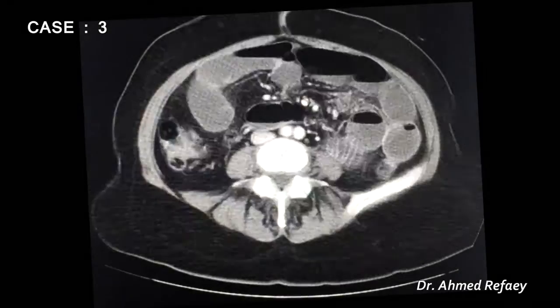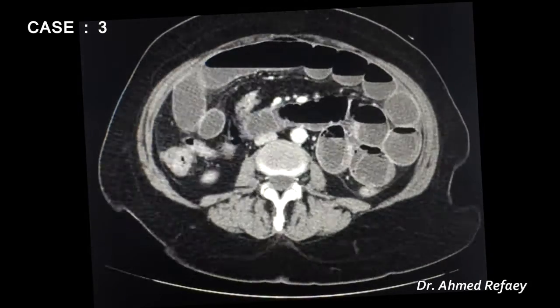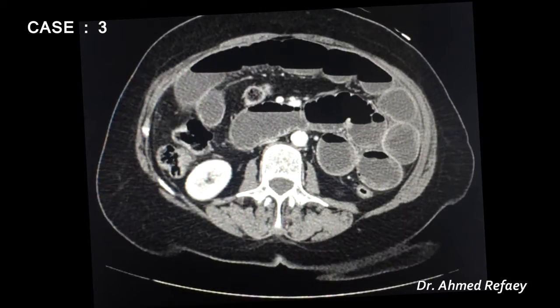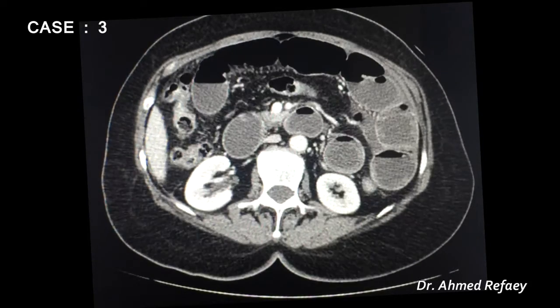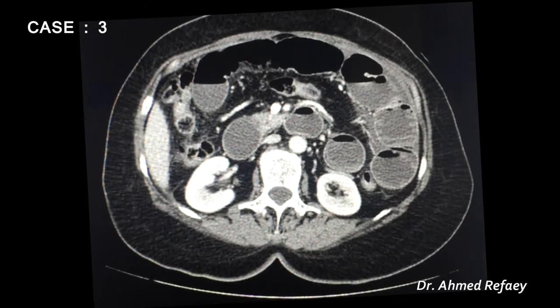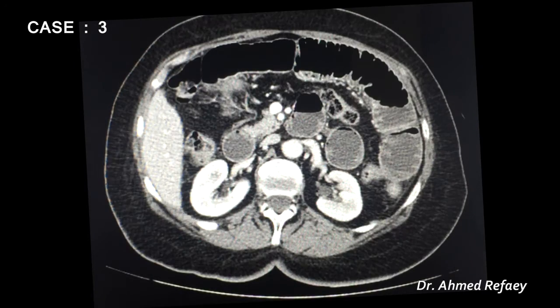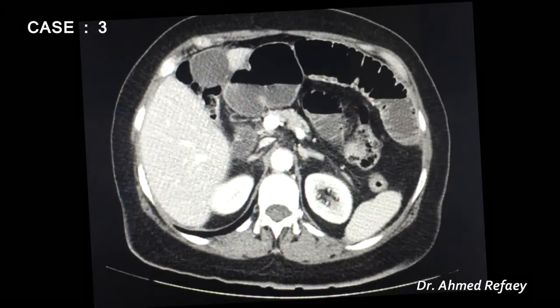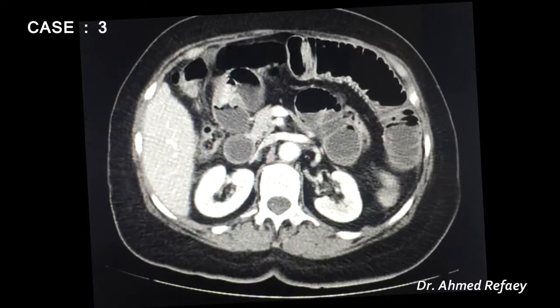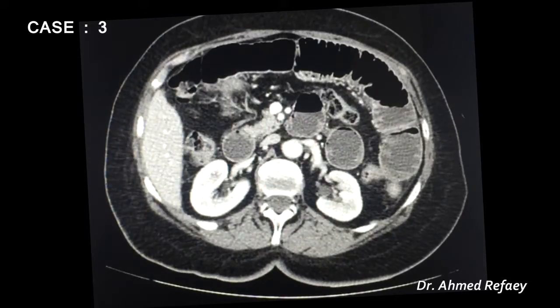Case number three: a 40-year-old female presenting with query intestinal obstruction. CT was performed with intravenous contrast and no oral contrast.